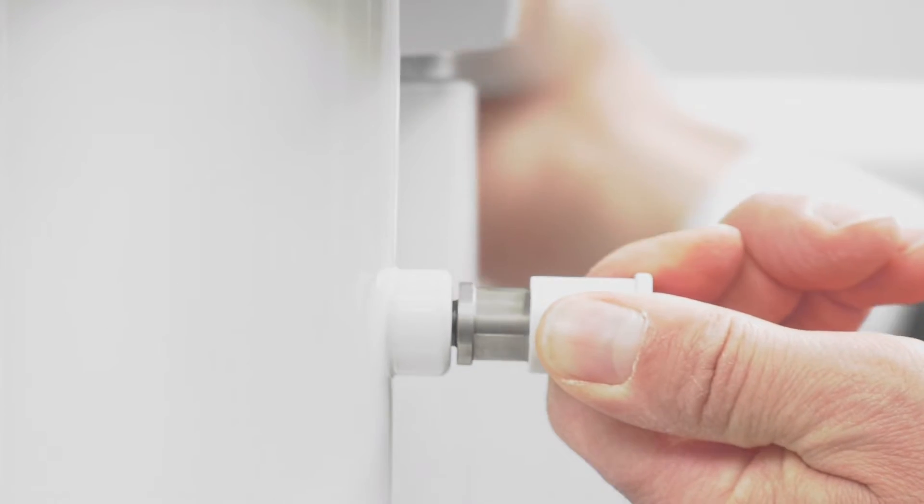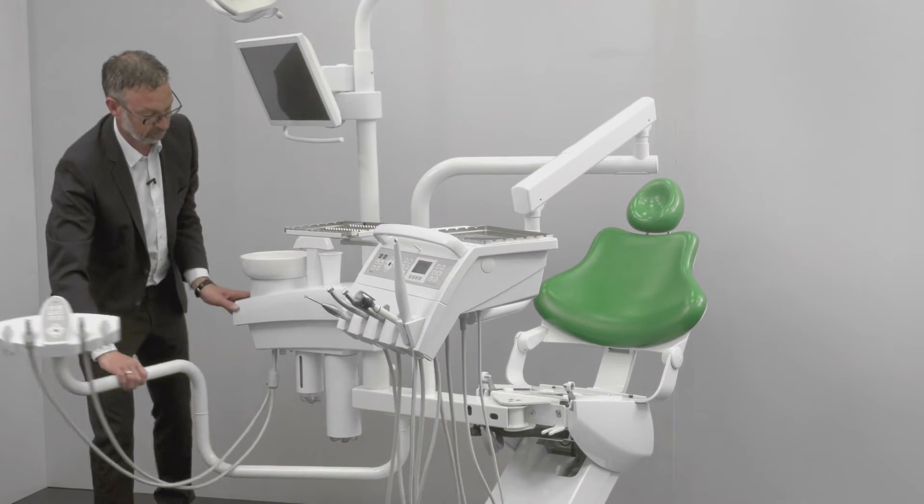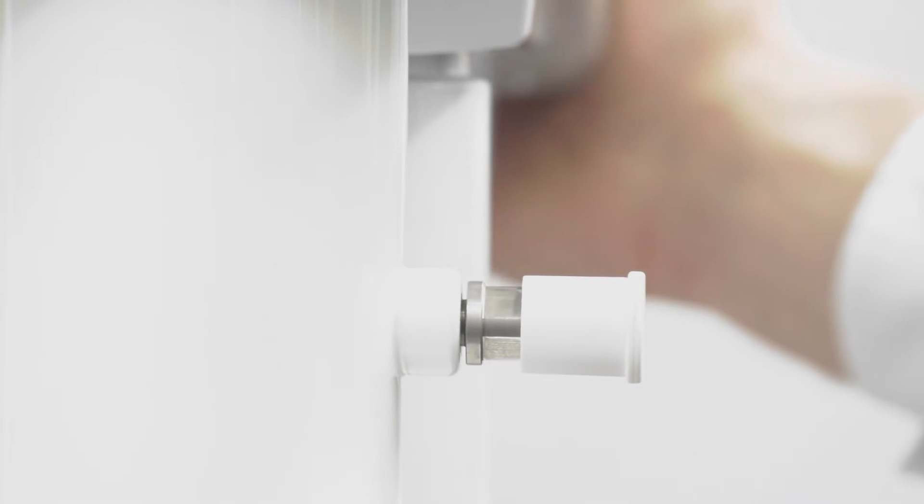Release the locking and swivel the unit body 180 degrees until the locking clicks into place again.